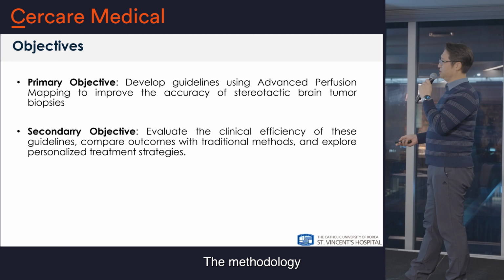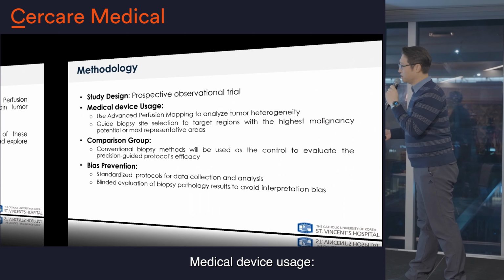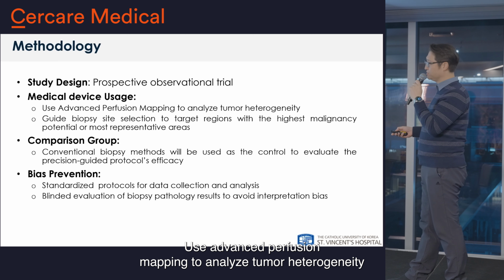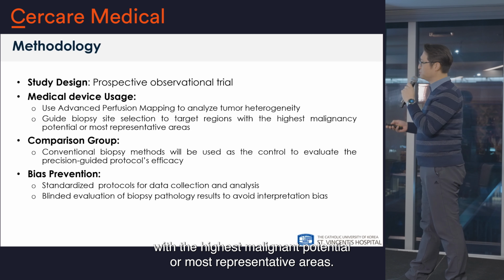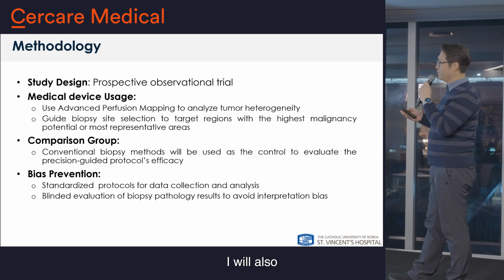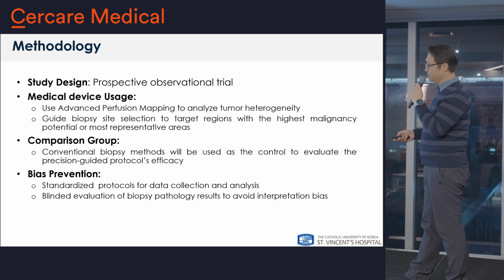The methodology of this study design is a prospective observational trial. The medical device uses advanced perfusion mapping to analyze tumor heterogeneity and guide biopsy site selection to target regions with the highest malignancy potential or most representative areas. I will analyze the comparison group.